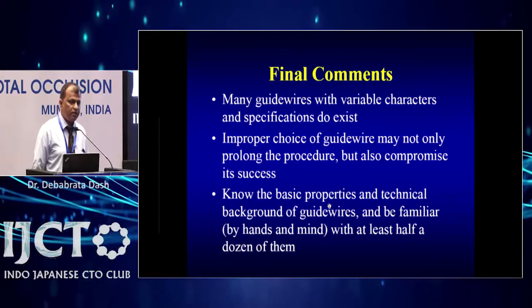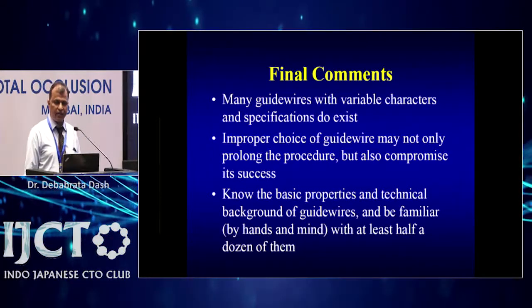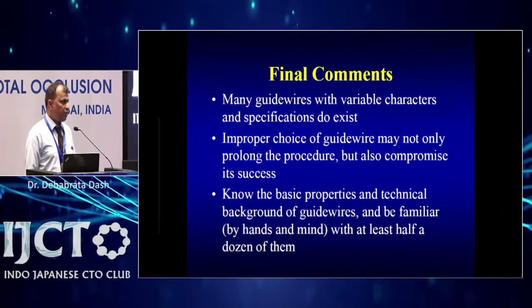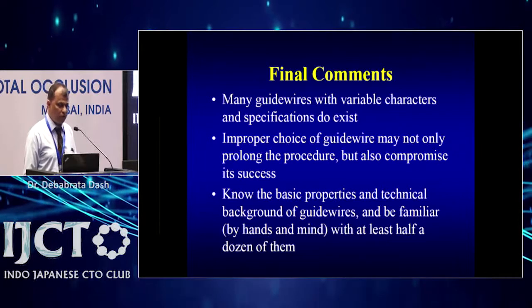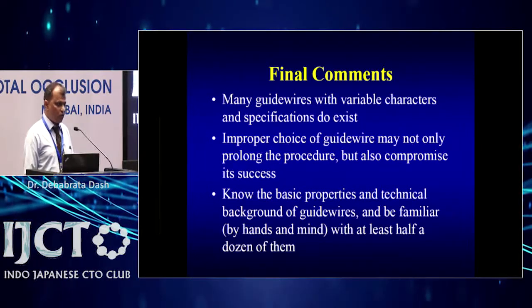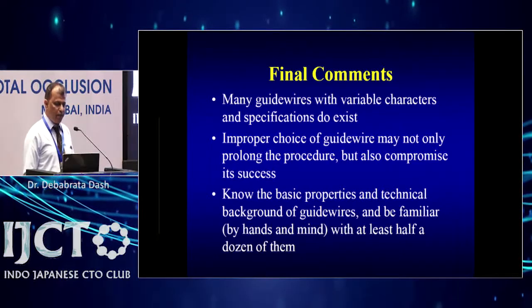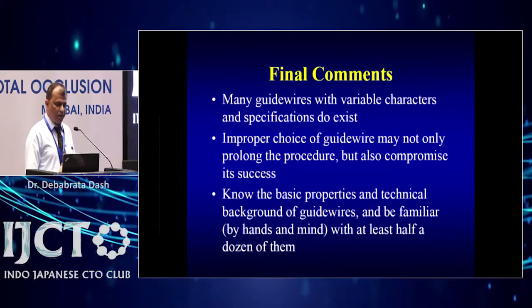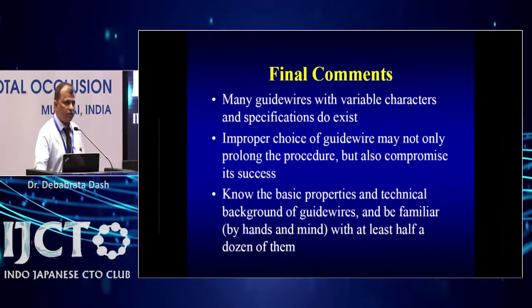My final comment: we have so many guide wires with variable characters and specifications. Improper choice of guide wires may not only prolong the procedure but also compromise its success. Know the basic properties and technical background of some guide wires and be familiar by hand and mind with at least half a dozen of them. Thank you very much for your kind attention.